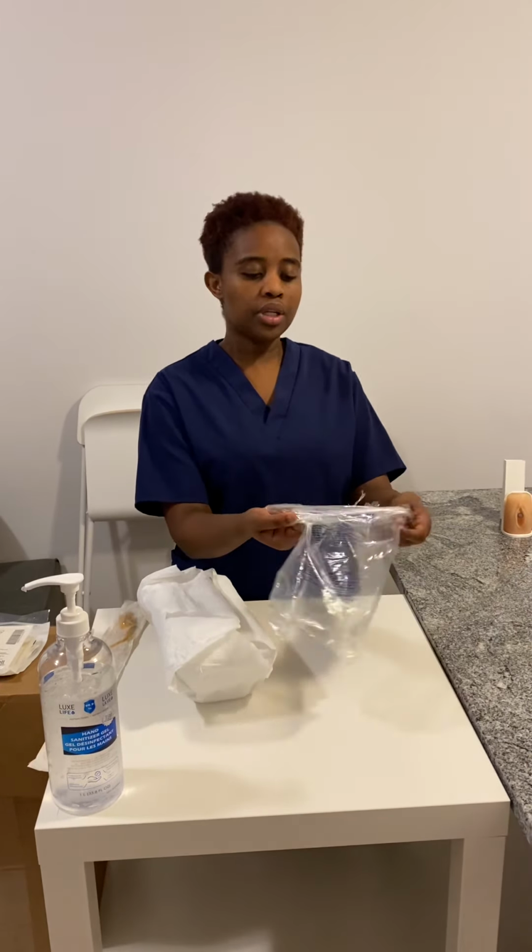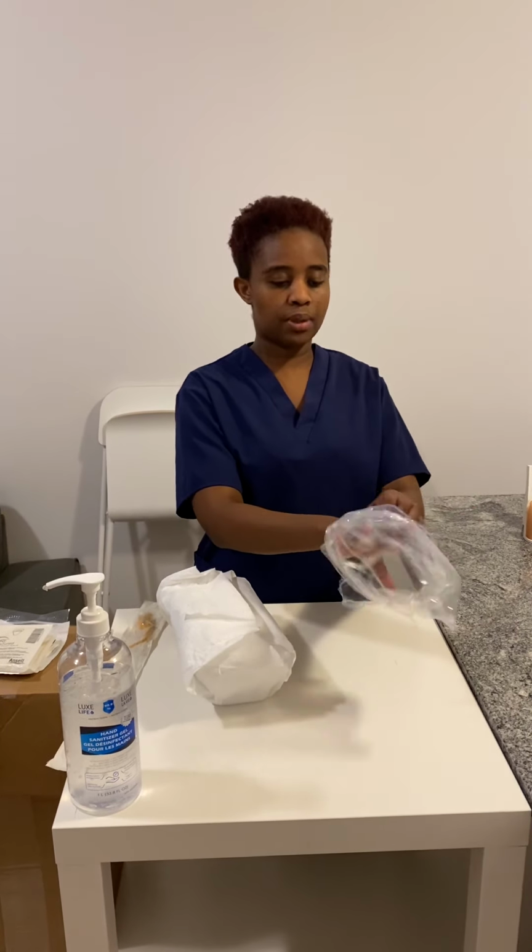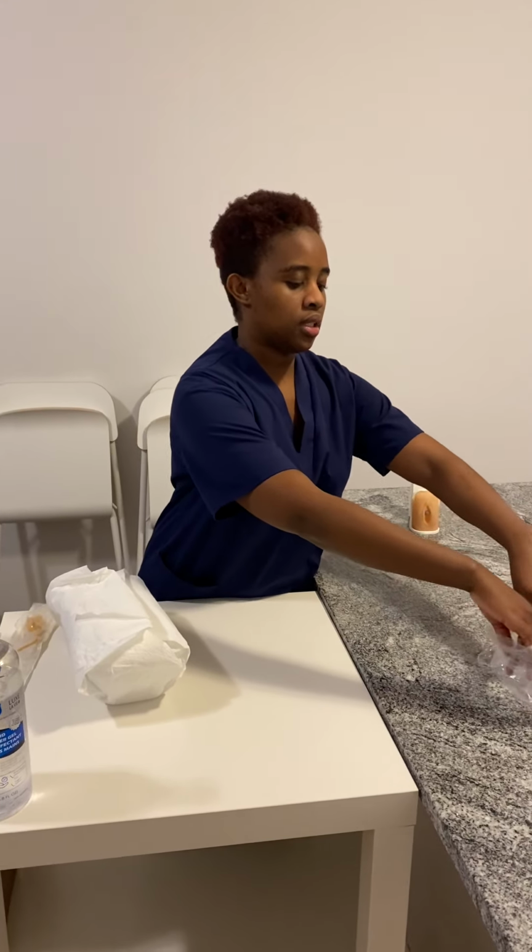So now I can go ahead and open the tray. I'm going to use this bag as my disposable garbage bag. So I'm going to open it wider. Okay, and then now I'm going to open my tray.